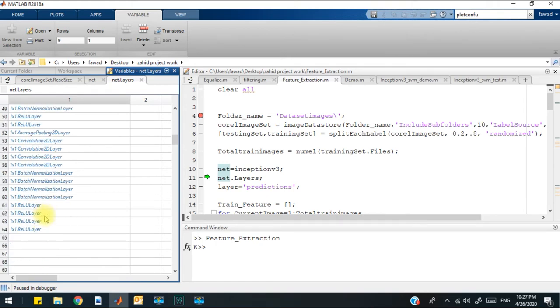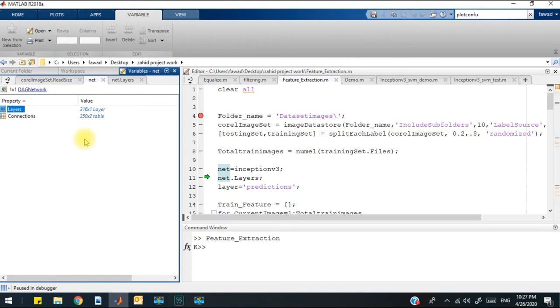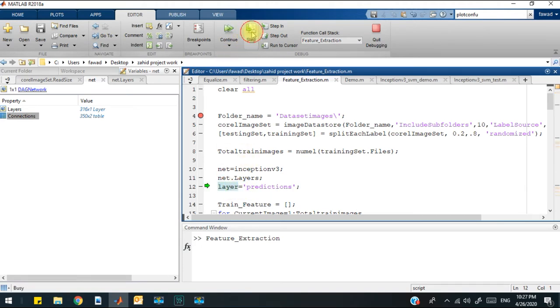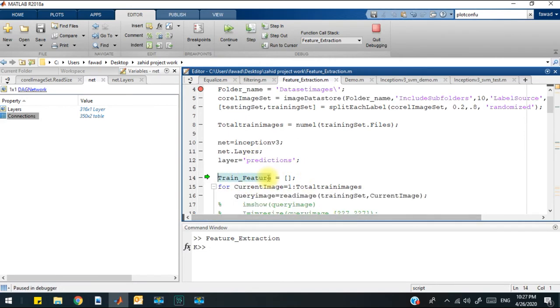You can open each layer from here. This is a set of connections showing how layers are connected with each other. I have defined a layer that is the prediction layer. From this prediction layer, I will extract the features.